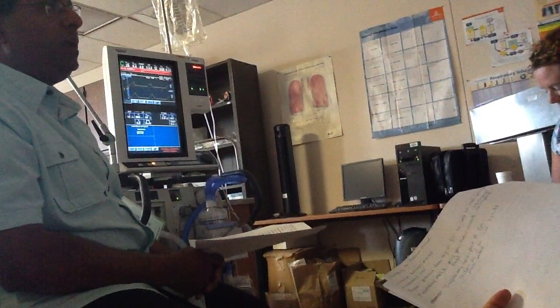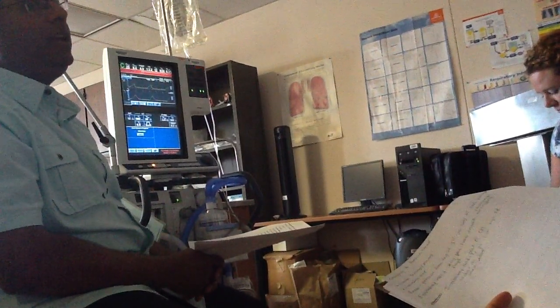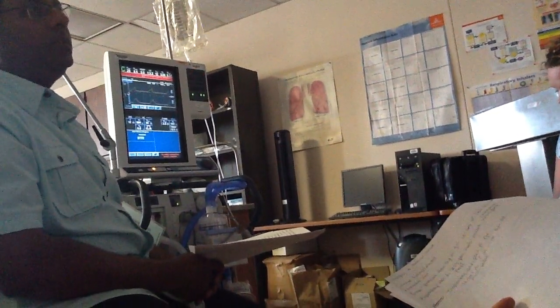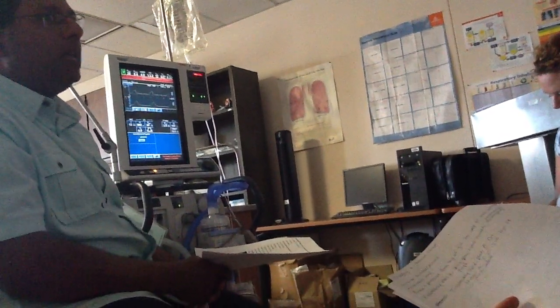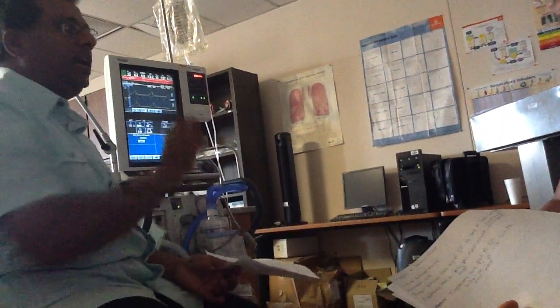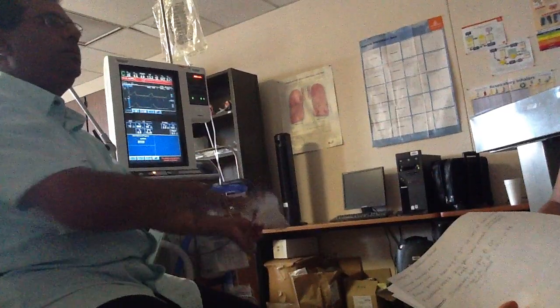Intrinsic PEEP is auto PEEP: you're not exhaling the patient fully. Therefore, you're creating some pressure at the end of the breath, causing the PEEP, which is the intrinsic PEEP. You're not dialing in that PEEP, you are causing that PEEP. That's the difference. Intrinsic PEEP, you're not dialing it in. You are actually causing it because you're doing other things.